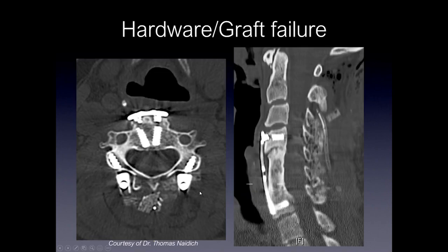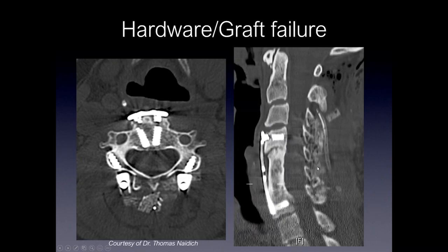Here's an example of hardware or graft failure in a patient who had both anterior and posterior fusion. There is fracturing of the vertebral screws, visible on both the axial and sagittal images. Looking at the fibular strut graft, there's good fusion along the inferior aspect of the corpectomy, but along the superior aspect there is lucency — consistent with some level of pseudoarthrosis and motion which resulted in fracturing of these screws. The patient ultimately underwent posterior fusion to secure the construct and reduce instability.